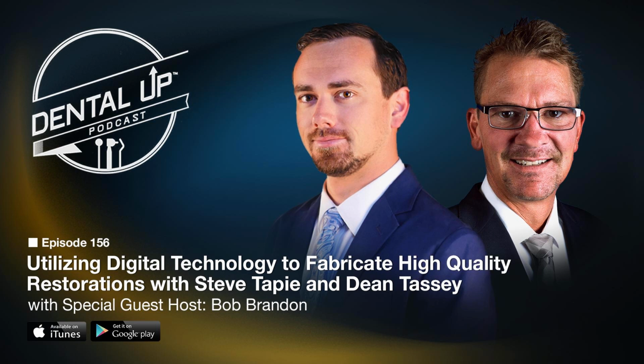CareStream is really taking off. We've seen a number of new doctors move over to CareStream. That system is really good because the doctor can mark the margin and we can view it and compare that to our own margin marking and make adjustments as needed. And I think I've heard that's a very cost-effective system as well.